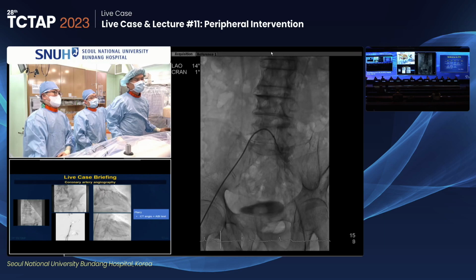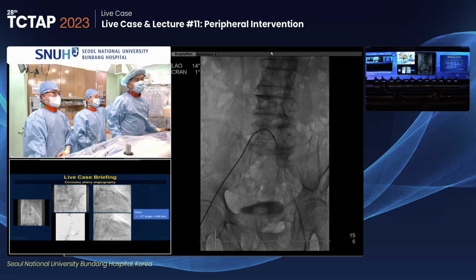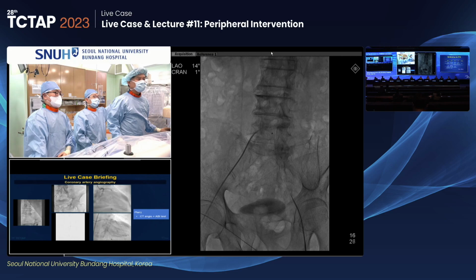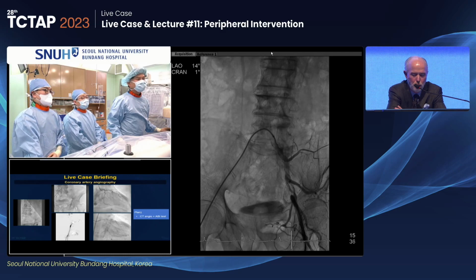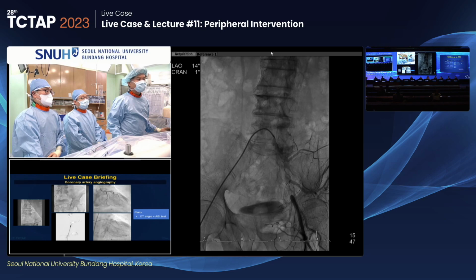This is the baseline bi-directional image. I'm using the manual injector, with one injection from the sheath, a syringe injection with contrast. It is still an ambiguous bi-directional image. Your LAO there, I think RAO projection again is the view to show the lesion, because you're overlapped with the internal iliac. So this is the overlapping. Multi-view, 30 degrees, RAO with some caudal would be the... Yeah, LAO, RAO, any angle overlapping.